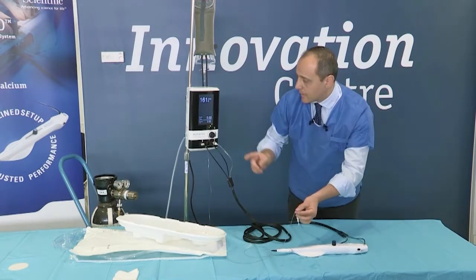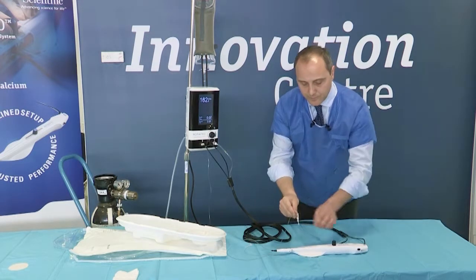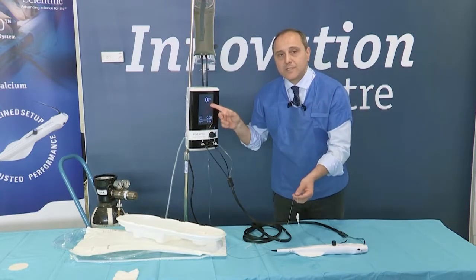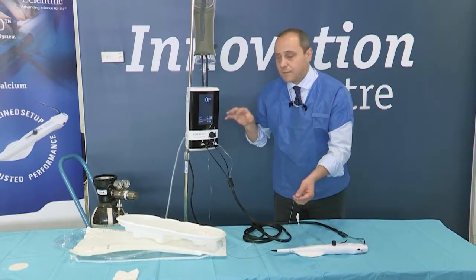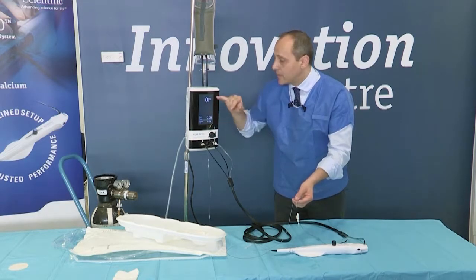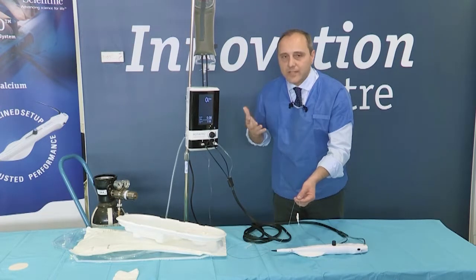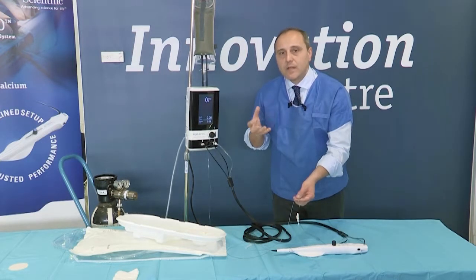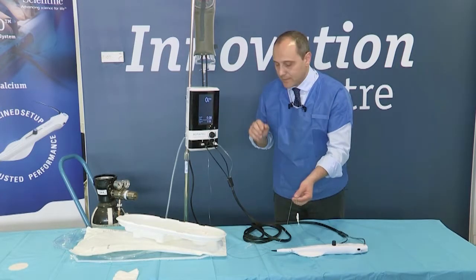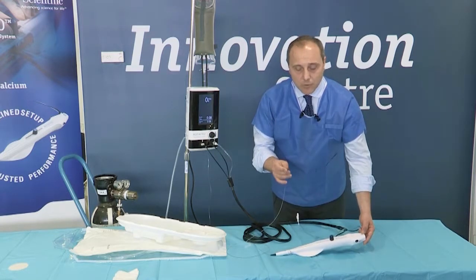Please notice the speed on the console. As you notice, the speed that is preset from the factory, from the company, is already 160,000 RPM, which is actually the most recommended speed of rotablation that we use in our practice. Let's also test whether the Dynaglide mode works.